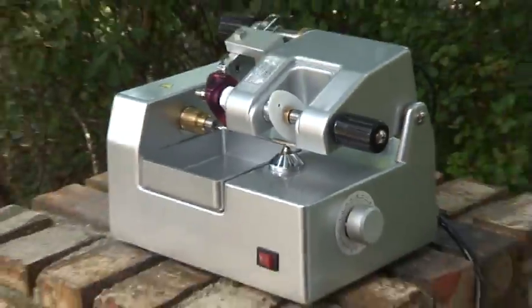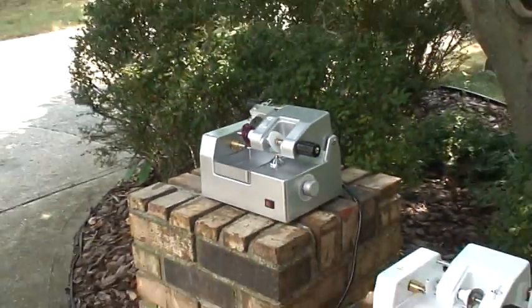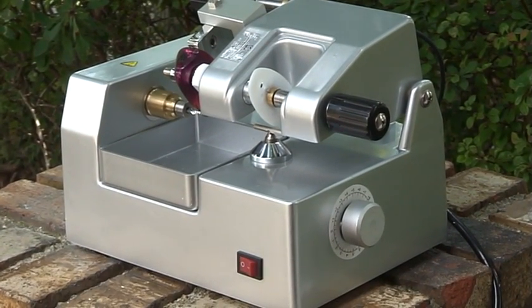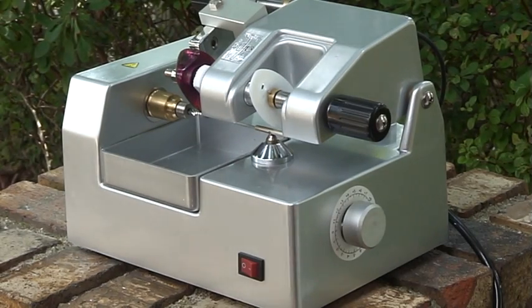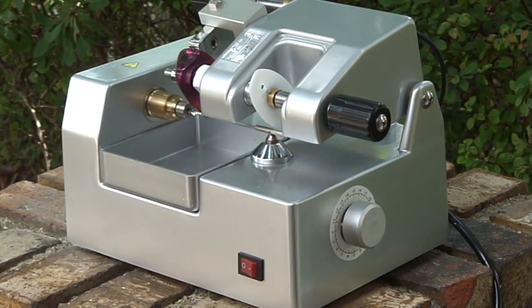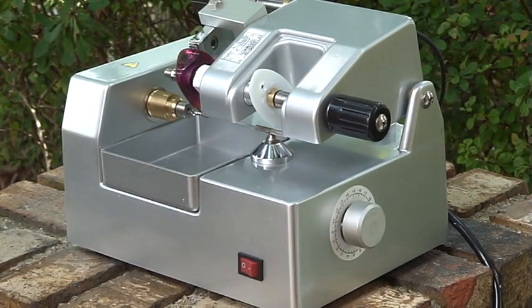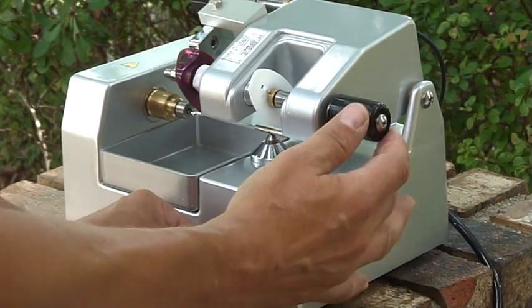And also, to prevent that from happening, I found it's beneficial to support the whole carriage while it's cutting, to prevent it from biting too much at one time and biting too deep. This cutter's also got an adjustment on the side of it that lets you raise and lower this post, which increases or decreases the size of the cut. But I've already aligned this, and we're going to go ahead and cut this real fast.